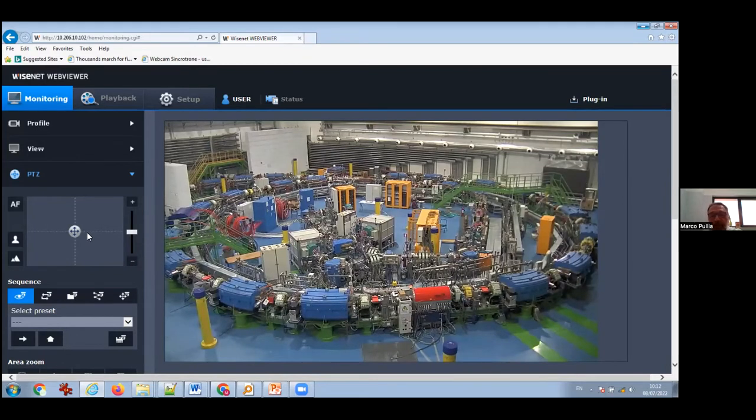I would say that we had an overview of the accelerator. If you have questions on the accelerator, we can maybe discuss it. Otherwise, we have a walk around now, and we go and visit the treatment room or the experimental room. So it will be a little bit slower because we are moving physically from one room to the other. But if you are patient, we bring you around now virtually. Do we have questions or curiosities about the accelerator?